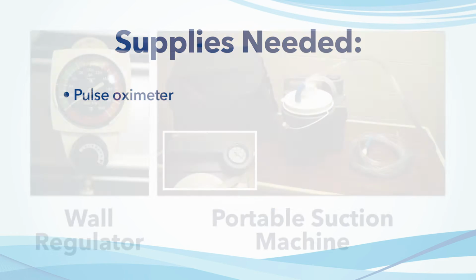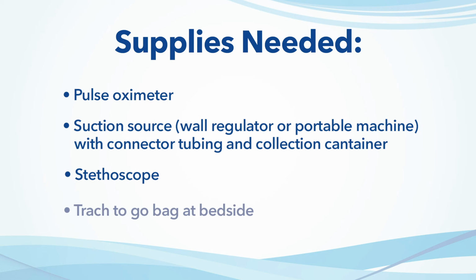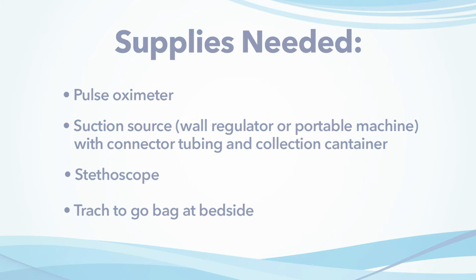Pulse oximeter. Suction source, so you'll need a wall regulator or portable machine, and have connector tubing and a collection container. Stethoscope and a trach-to-go bag at the bedside.